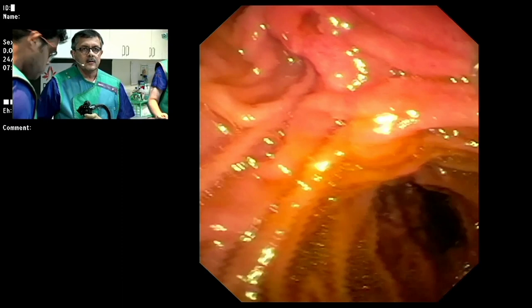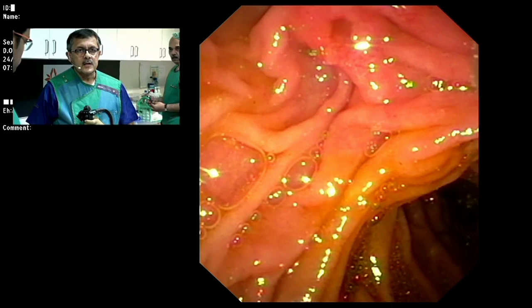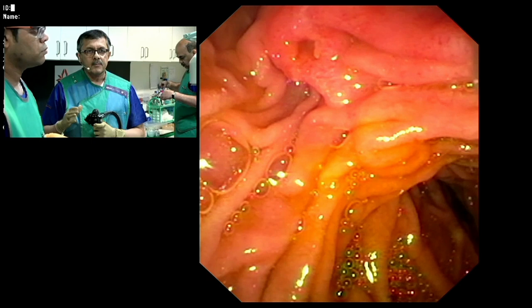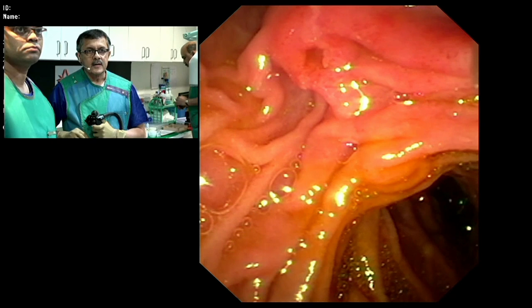So now I come to the patient, and this is a 50-year-old person who has got a 4-centimeter lesion in the head of the pancreas and with a borderline resectability, because they have shown that a lesion is abutting against the superior mesenteric artery. The biopsy has been proven to be adenocarcinoma, and this patient has been referred to us for a biliary stenting. As all of us sitting there are probably experts in ERCP, I've already passed the duodenoscope inside the duodenum, and you see the ampulla of Vater in view.